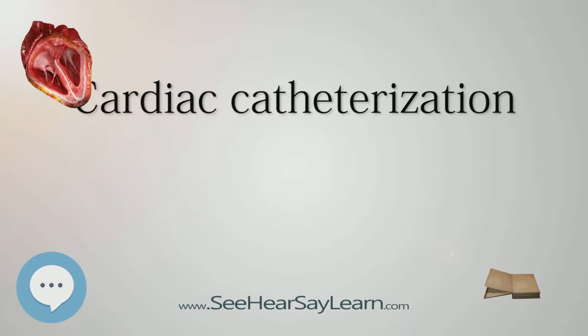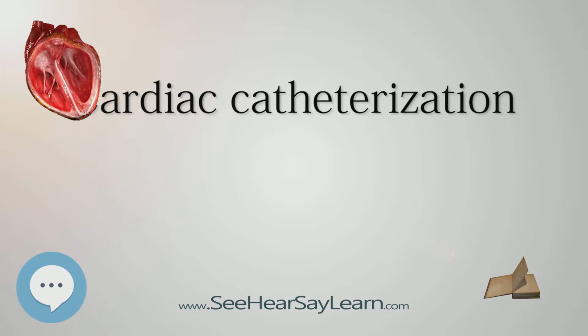In this position, the interventional cardiologist can inject contrast and visualize the flow through the vessel. If necessary, the physician can utilize percutaneous coronary intervention techniques, including the use of a stent, either bare metal or drug-eluting, to open the blocked vessel and restore appropriate blood flow.